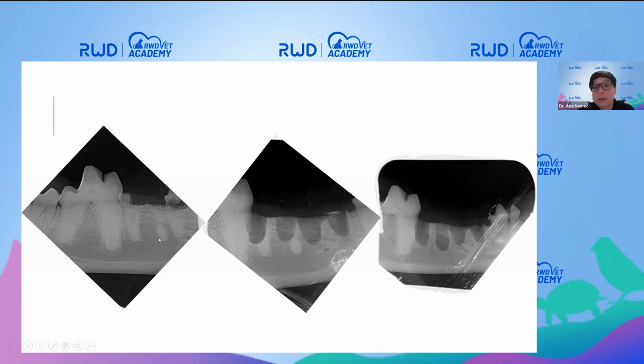So these remnants of teeth, these roots, need to be removed, and this is very, very challenging. You can see here that it's very easy to stray, to misguide yourself, causing even problems to adjacent healthy teeth. And these little root tips, which are lying just above the mandibular canal, are also prone to being pushed or can slip into the mandibular canal. So these indeed are absolutely challenging extractions.